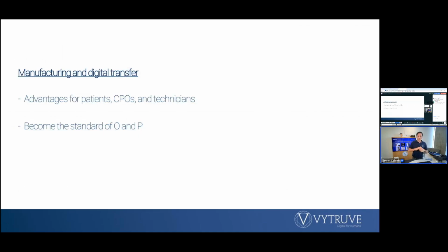So to sum up a little bit, now it's really the end of the plaster from the patient to the definitive socket, with the possibility to scan the patient on stump, to scan the patient on liner, to design a check socket.